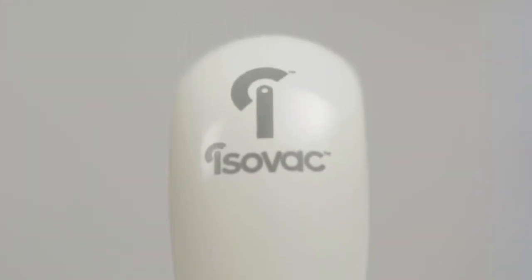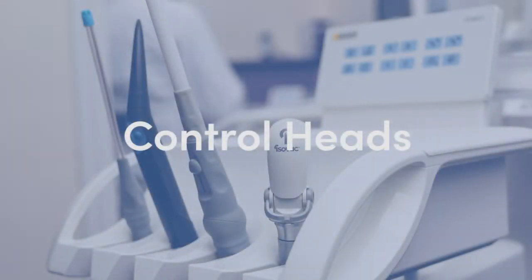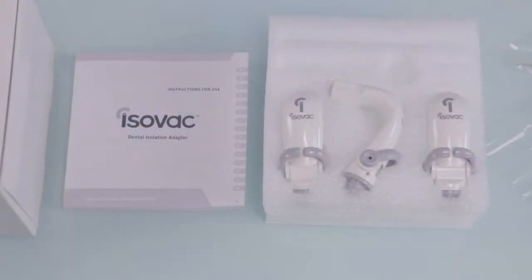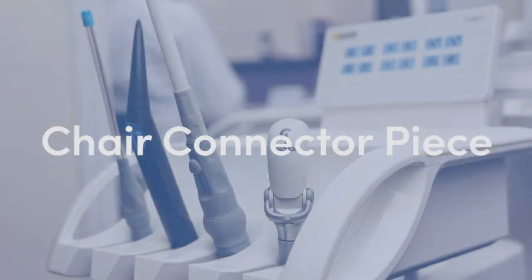To install your Isovac dental isolation adapter, first, ensure you have all the proper components ready. Your Isovac comes with instructions for use, 3 Isovac control heads, and accessories. 3 control heads are provided, so one is always ready when you need it. 1 on the chair, 1 in the autoclave, and 1 ready for your next patient.